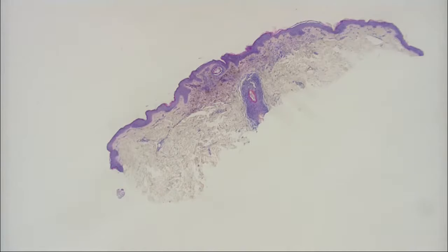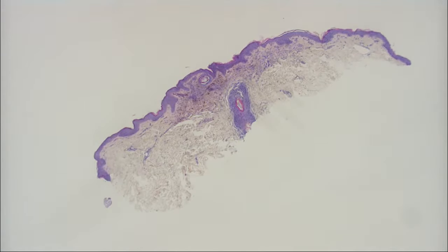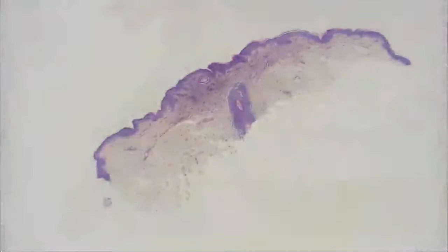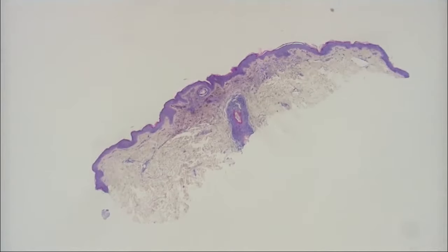What do we have here? So here we have a shave biopsy of non-acral skin. It looked like it had something going on in the dermis. That's where a lot of the action was. We see, from a far view here, it looks like pigment in the dermis. This is more of a far view. From this mid bird's eye view, we see what appears to be pigment in the dermis.